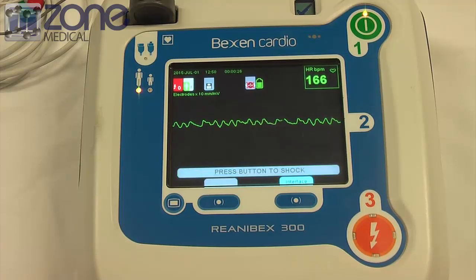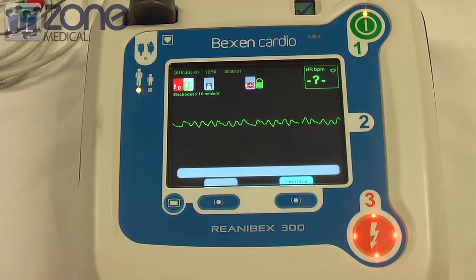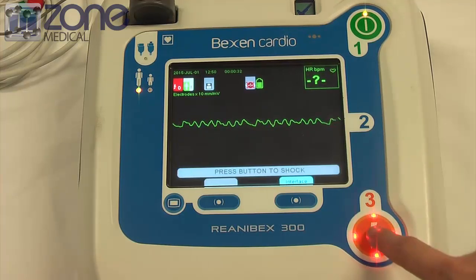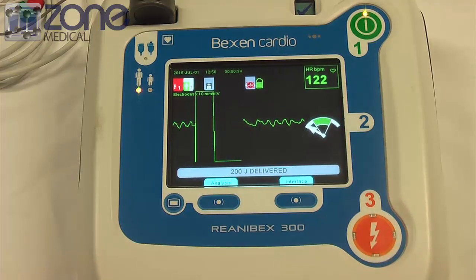Do not touch patient. Press the flashing button to deliver shock. Begin cardiopulmonary resuscitation.